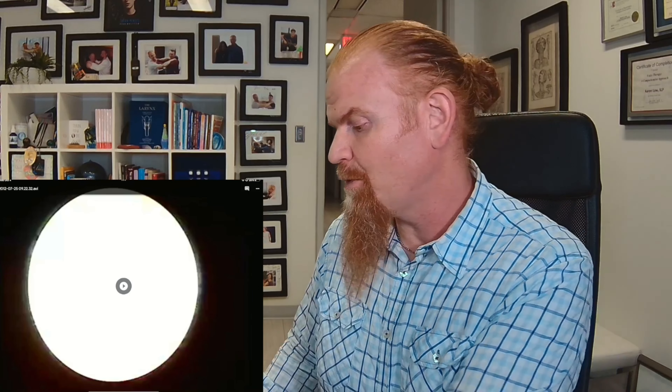Hi, welcome back. It's Aaron Lowe with Master the Voice. Today we're going to look at some vocal cords in slow motion. This is a test we call video laryngostroboscopy, and the cords that you see are a little bit damaged in the middle. They're moving at a middle C pitch, which is 261 hertz, which means the vocal cords are touching 261 times per second, and you see it in very slow motion replay.